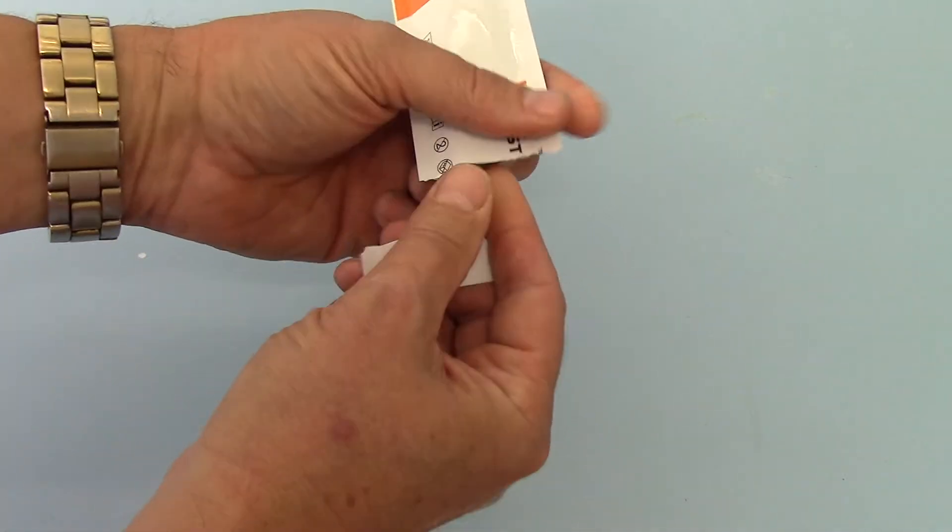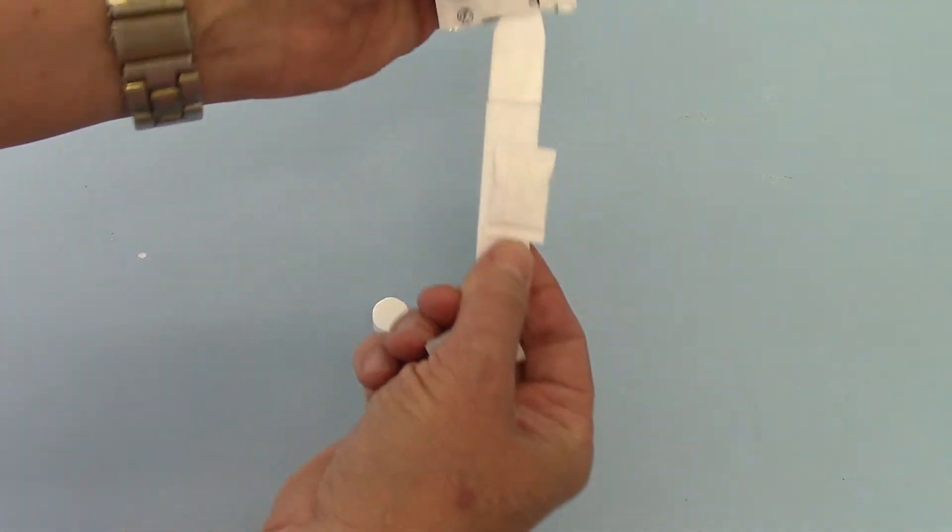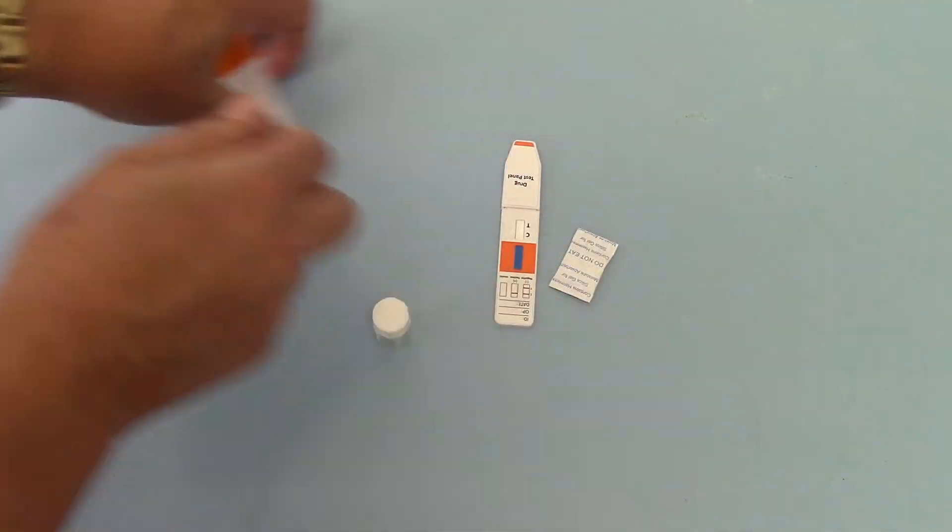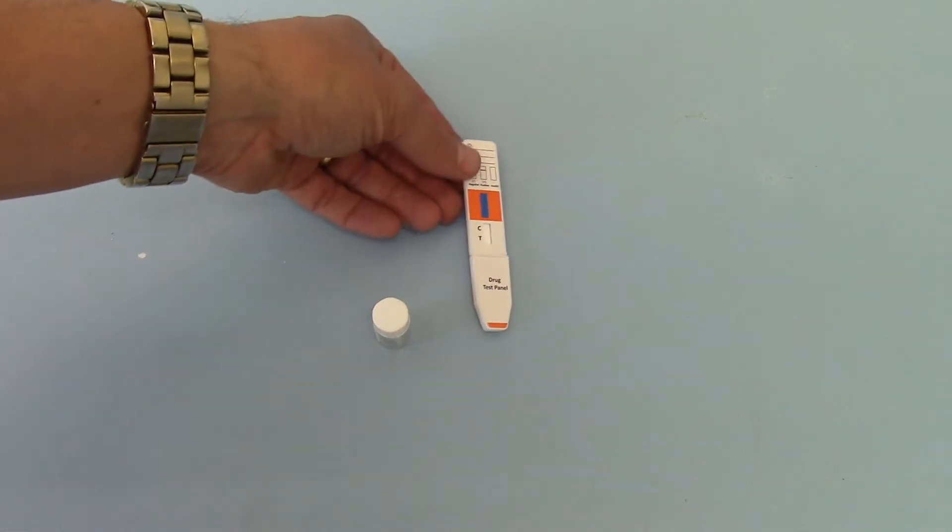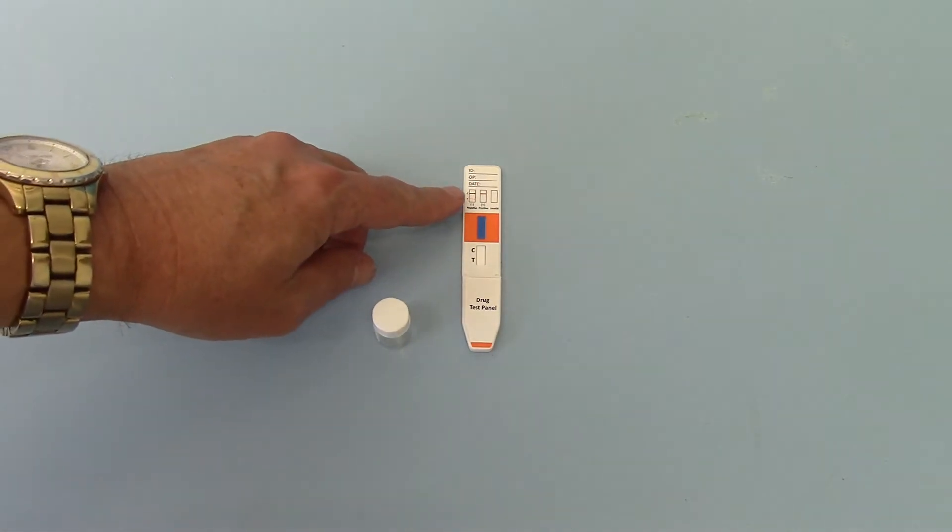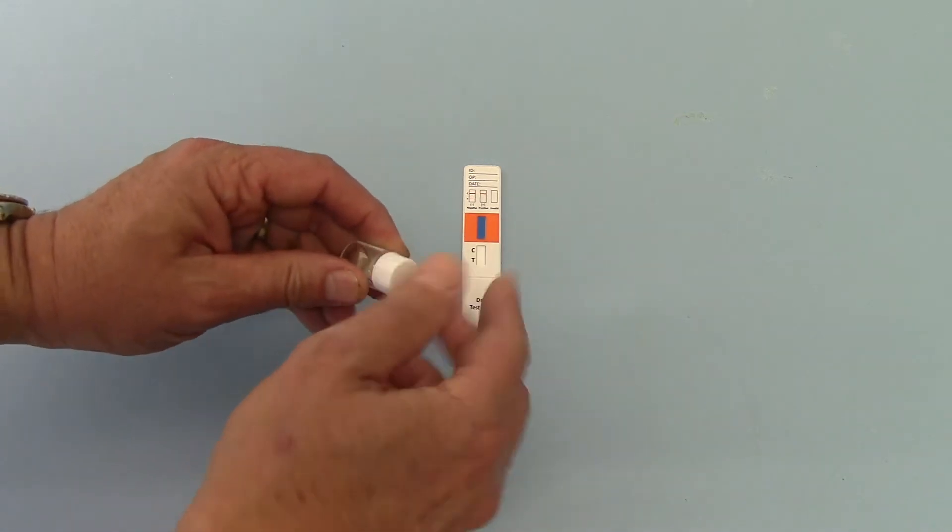So if I just remove this test from its foil, you get a bag of desiccant which is just to keep the test dry. And then this is your test panel with a control and test line with indicative results on the top of the panel.